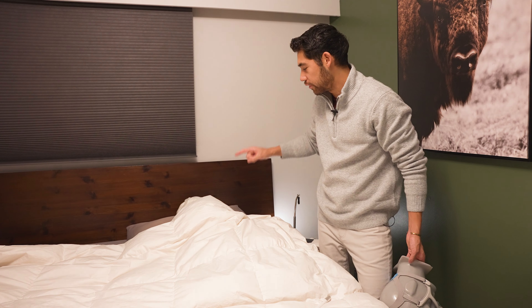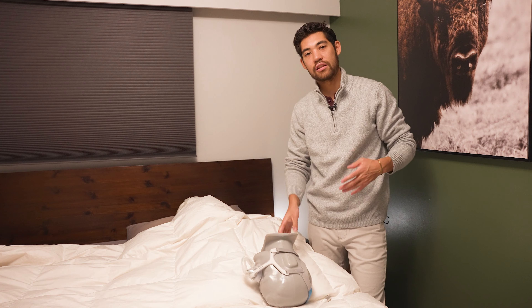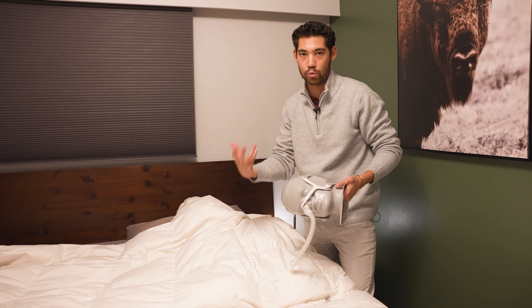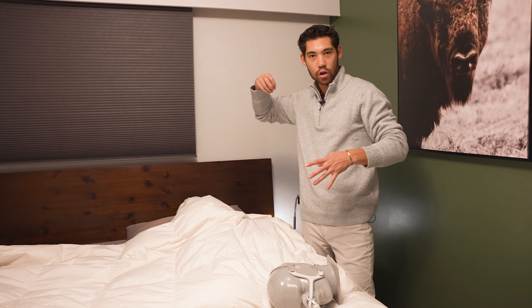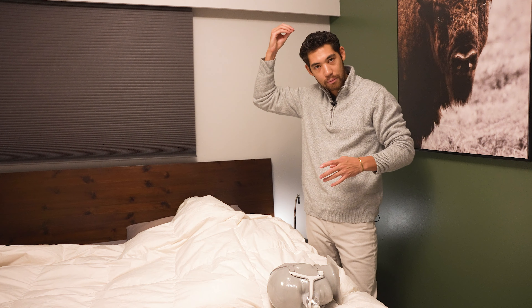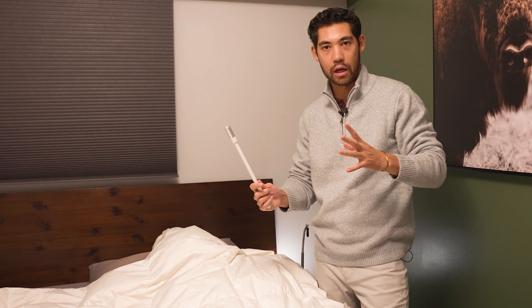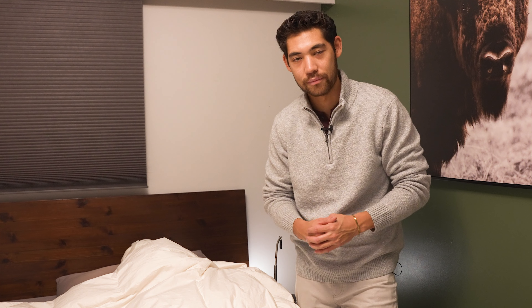What if you don't have a hollow frame mask? What if your favorite mask is the N20 or a front-mounted mask? The answer is yes, this will absolutely work for you. Having the tube elevated reduces the weight and dragging of the tube no matter what. However, it works best with a hollow frame mask because it's almost built for a tube hook — it's already away from your face. Tube hooks definitely work best with top-mounted masks, but they work with any mask. I'll have separate videos reviewing both the Raptor and the Houdini, including an unboxing. But for now, I hope this explains what a tube hook is, why people use it, and how it makes your sleeping a little bit easier. Take care.